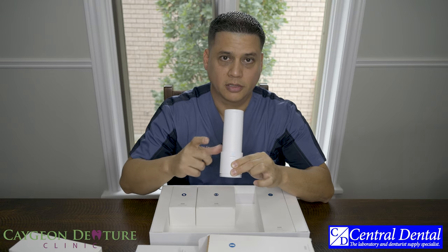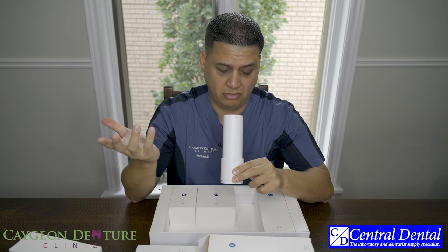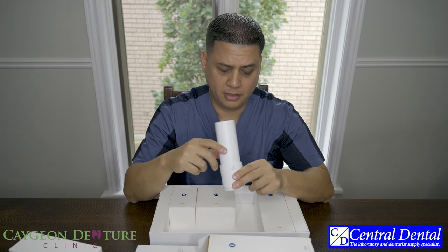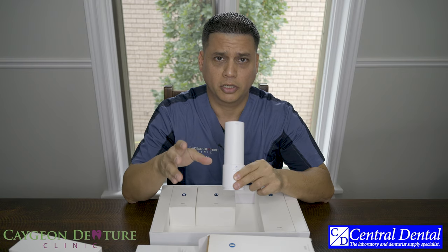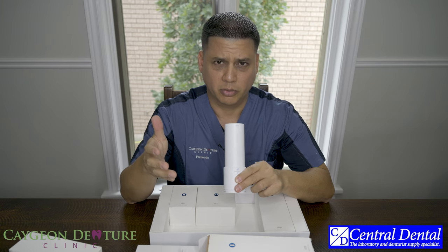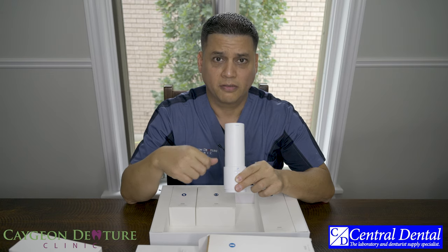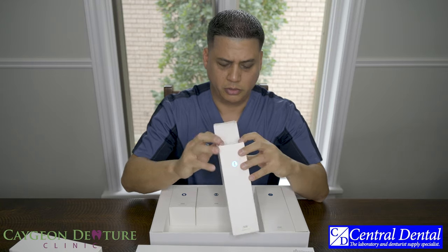You spin it over to number two, then number three, and so forth until the software says calibration is done. This takes roughly a minute or two to complete. That's just when you first start using the scanner. Once you calibrate it — which I believe they tell you to do every 15 days — it goes fairly quickly. That is the calibration tool.